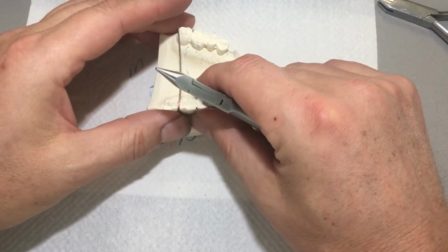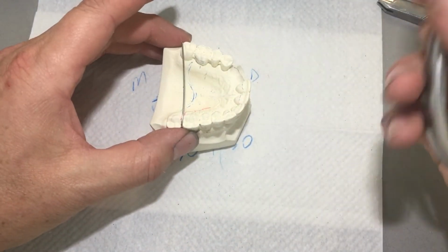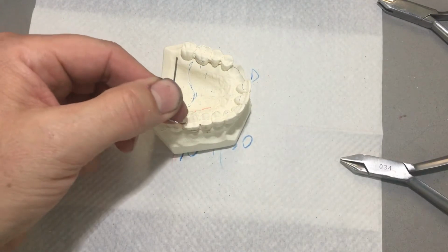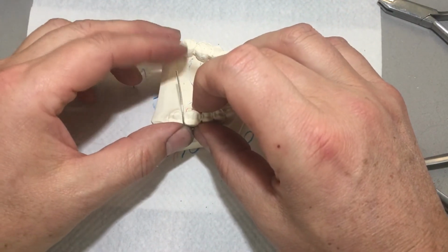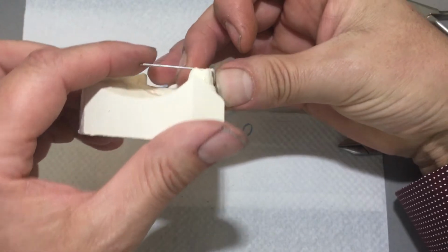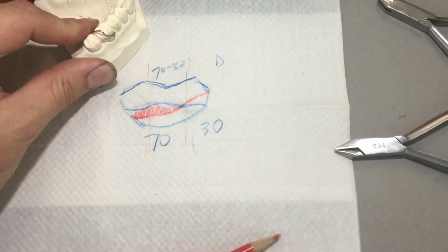Now here is another moment of truth where I've got my wire hitting the other side and I can't gauge what's going to happen. So now I've got to say, you know what? I'm going to cut some length off because I don't need all that. That'll give me some freedom to bend the wire over the occlusion. If I look this way, do you see a space? Yes, I do. So really, we could bend the wire.